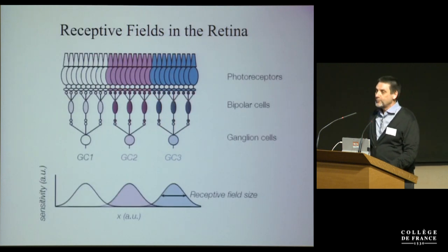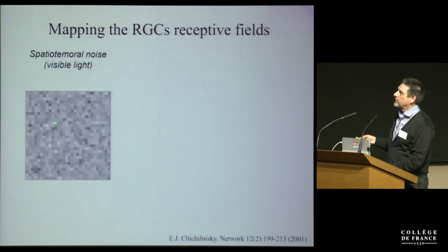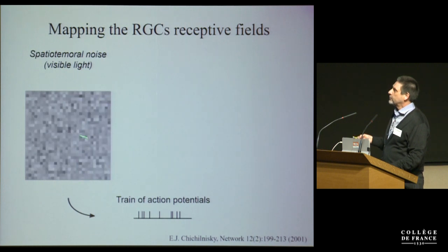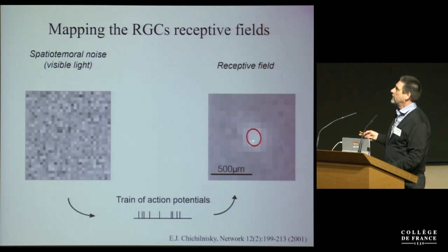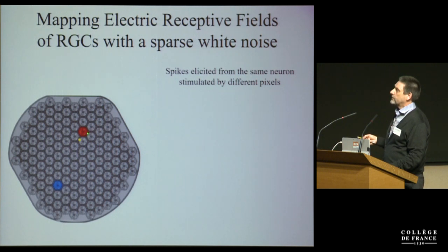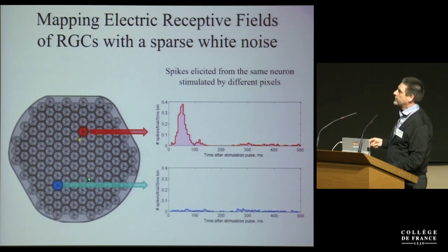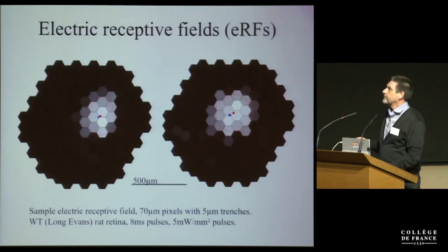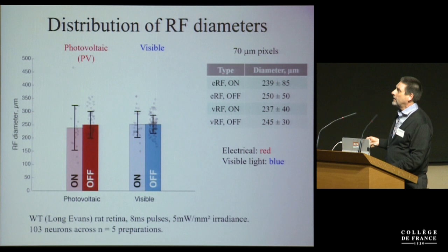Okay, now a very important theme obviously is resolution, and the retina is arranged in converging circuits from photoreceptors to fewer bipolar cells and fewer ganglion cells, and the area that contributes to each ganglion cell is called the receptive field. So we study it by playing spatiotemporal noise and recording the response to it and identifying which cell responds to an increase in light and which to a decrease in light, and thereby we can map receptive fields. We can do the same with our photovoltaic array and measure the response of this neuron to, say, this pixel. It's very strongly responding, and it's not responding to this one, so it basically can be mapped also as a receptive field. And if you compare the sizes of receptive fields of normal and prosthetic vision, they are the same.